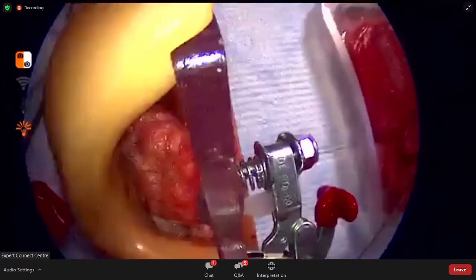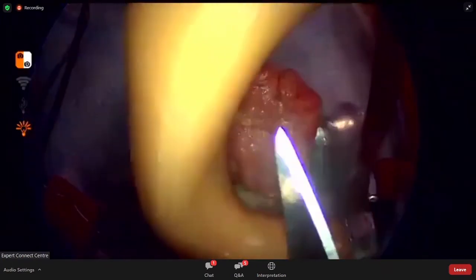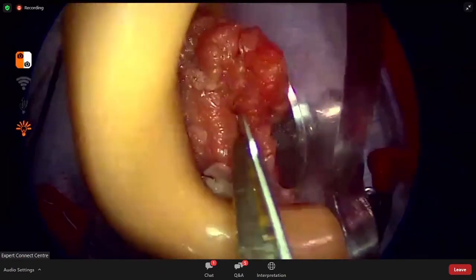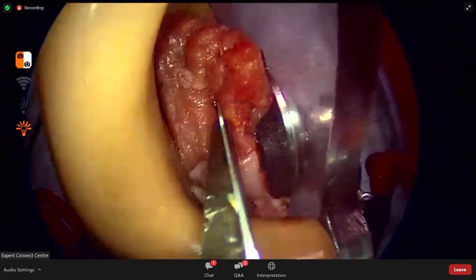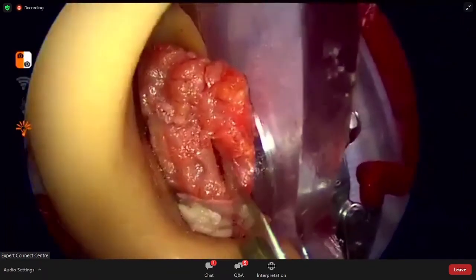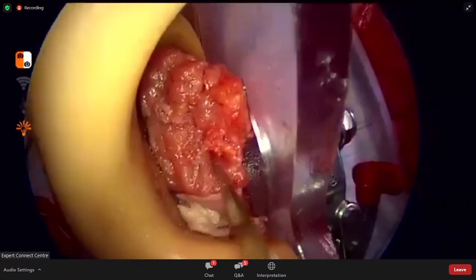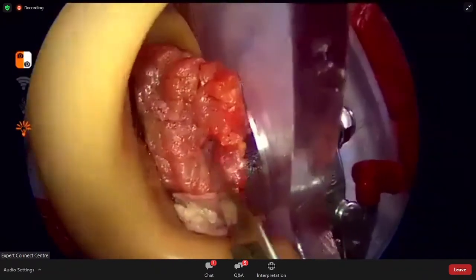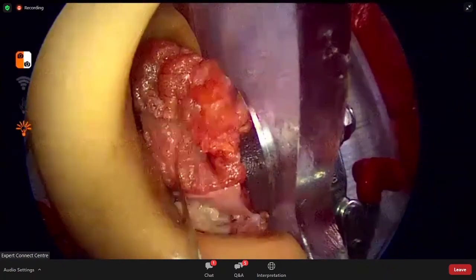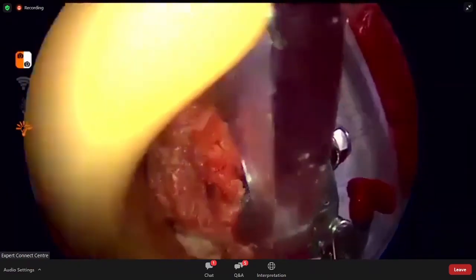So very similar to the video I demonstrated earlier, it's a stab incision with an 11 blade at the head of the inferior turbinate, right down onto bone. Yeah, and that's all I do. So a single stab incision, and if I don't perforate the mucosa, this is the only area that will bleed during the operation. And if I do not coagulate, then this is the area that might bleed postoperatively, or certainly be the area where I find crusting when the patient returns to clinic at 3 to 4 weeks post-op.